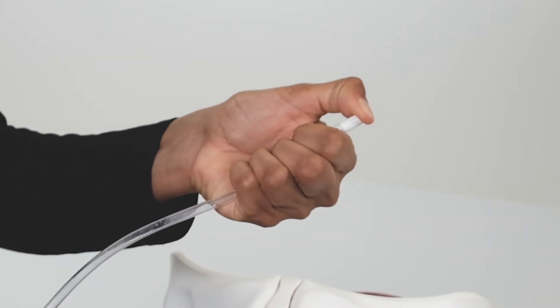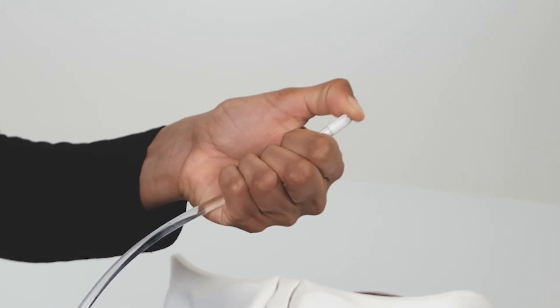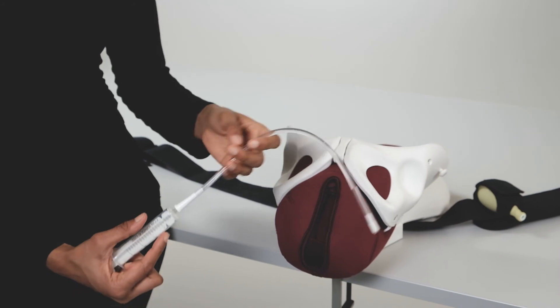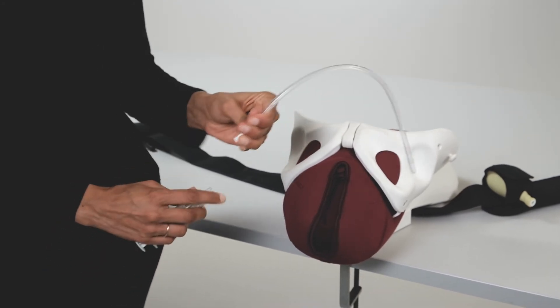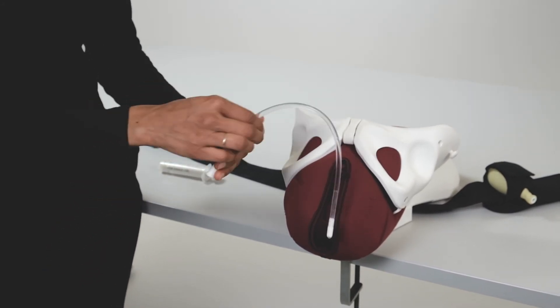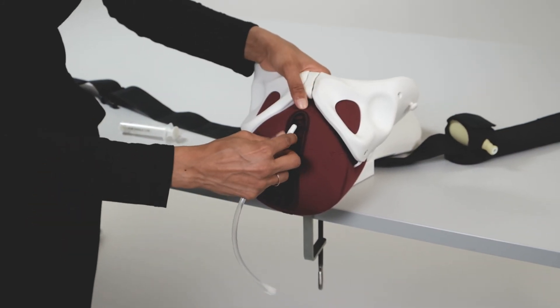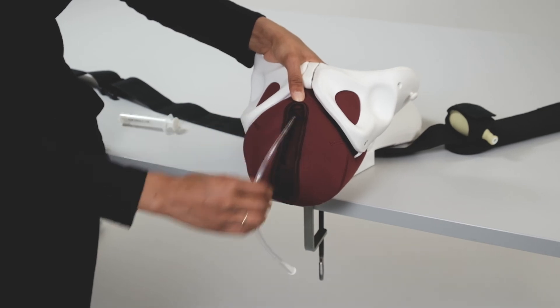Insert a syringe filled with 5 ml of water into the catheter. Press the button on the end of the catheter while injecting the water. Insert the end of the catheter into the urethra. When the catheter is in the correct place, some water will come out.